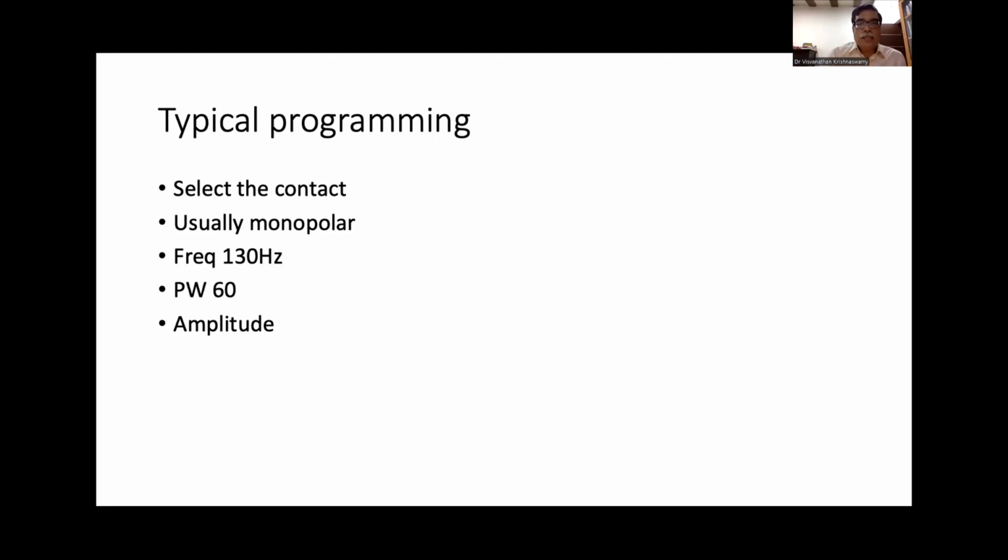Now, the newer electrodes are also coming in the market, like directional leads, where the stimulation can be more precise, but it would require a lot more work in the outpatient clinic.